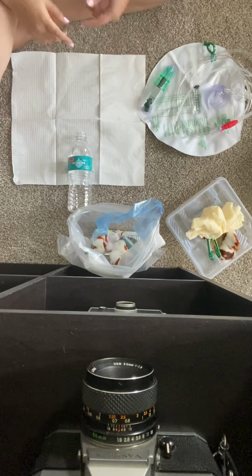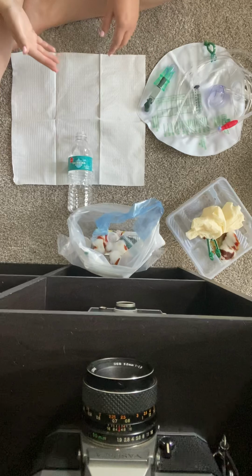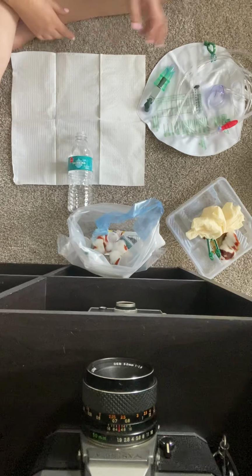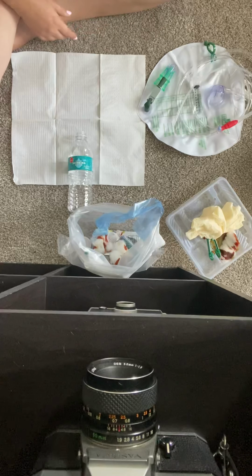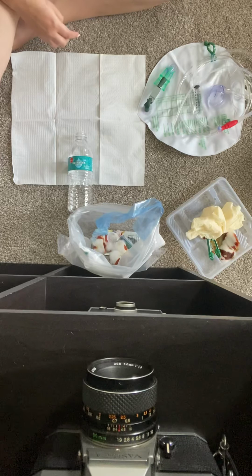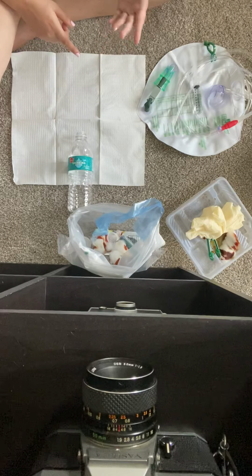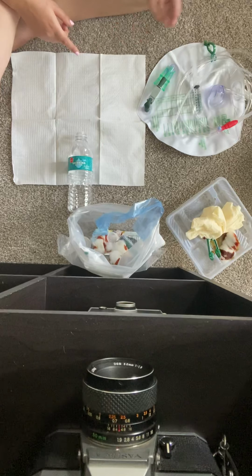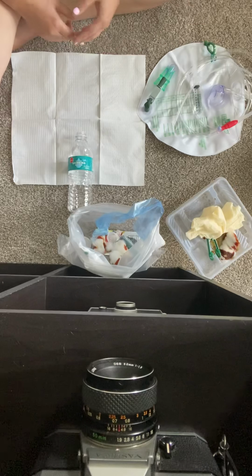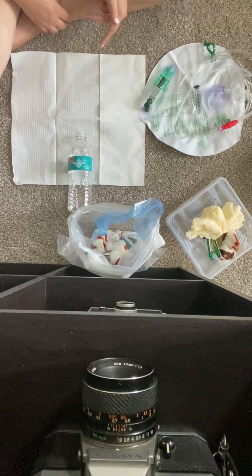And then the catheter, the patency of the catheter. So just making sure that urine is coming through. If you got the flashback of urine, then you're obviously in the right place, and you just want to make sure it's still draining. The amount, if an initial amount came out: sometimes you bladder scan your patient, they say to put in a Foley, and they initially put out like 600 mils, you would want to go ahead and empty that and note that, just because that's your initial output.